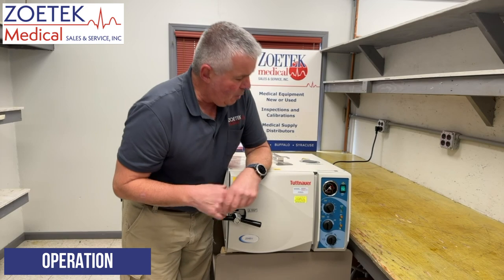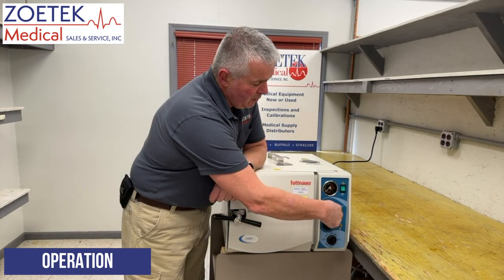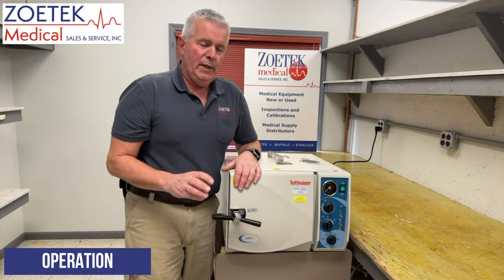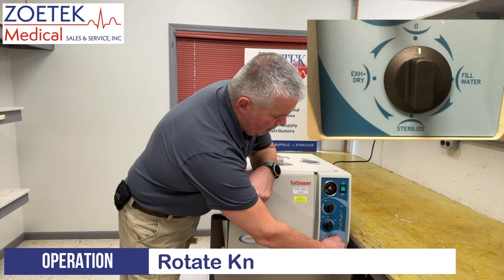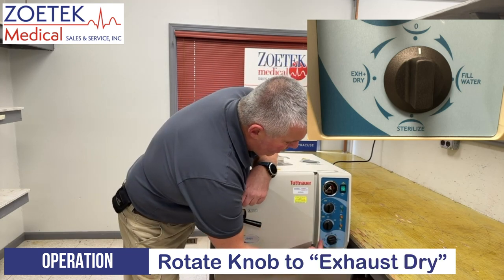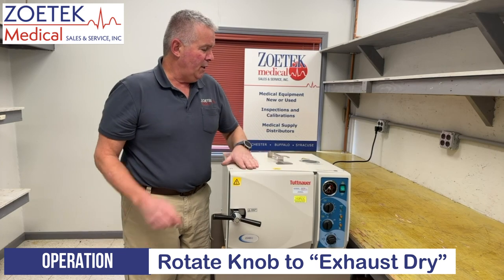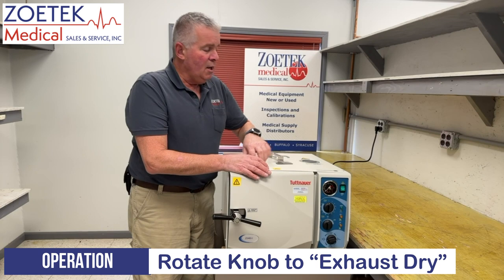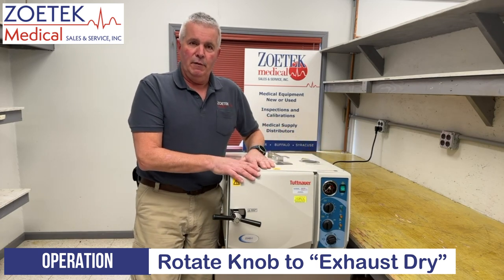Once the sterilizer has run for its required time, the timer will come down to zero and you'll hear a ding. At that point we need to go back to our function valve at the bottom and turn it one more quarter turn clockwise to the exhaust/dry position. At that position you'll hear the steam, pressure, and residual water in the chamber pushing back up into the reservoir — it'll give you a little bit of a rumble, which is normal.